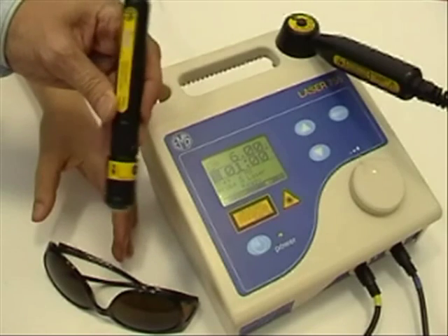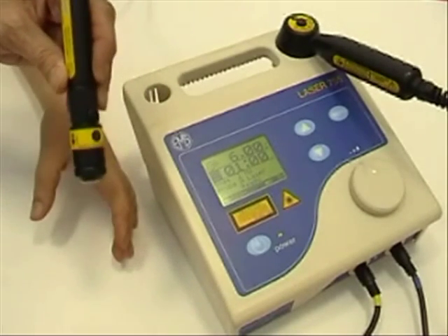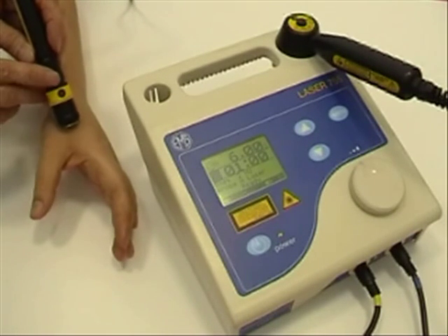The probes are activated once eye protection goggles are worn by both user and patient, and the treatment can then be easily and effectively applied.